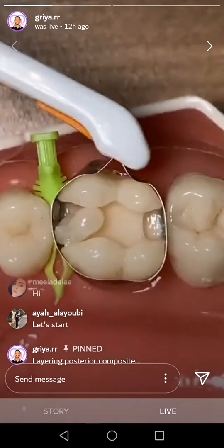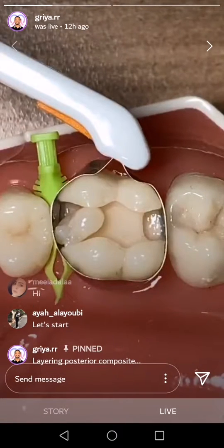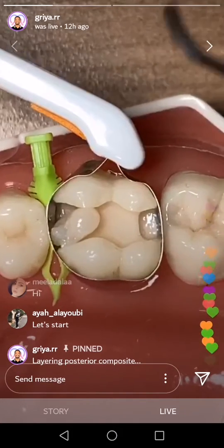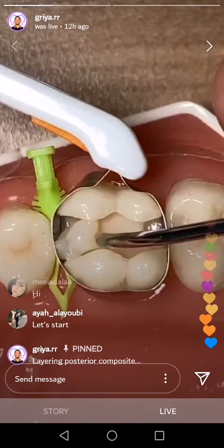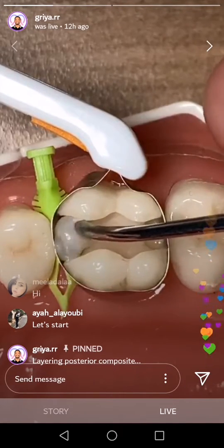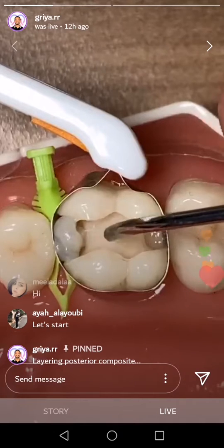Many of you ask, maybe Dr. Griya, do you need to make the composite hot? The answer is no. I'm not using a heater.